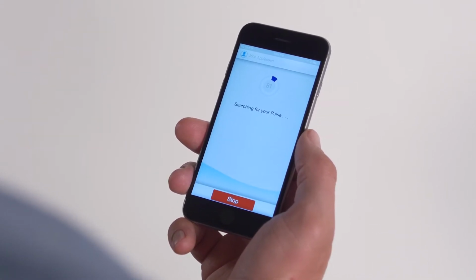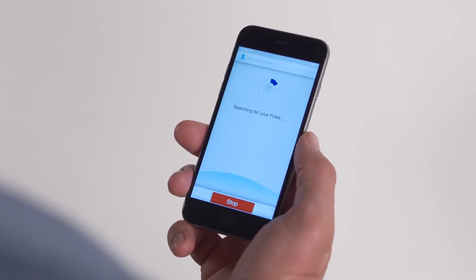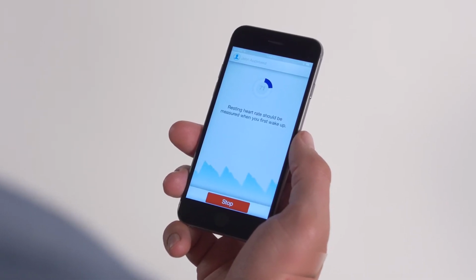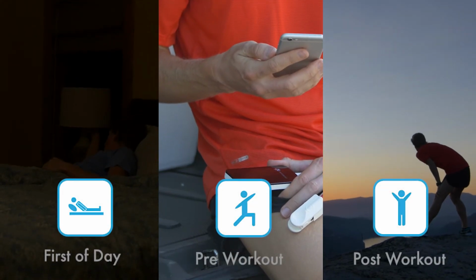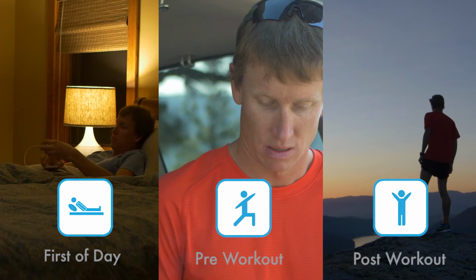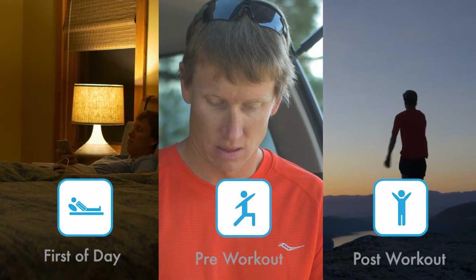Every time you test, the app will ask you to associate an activity with your measurement. By selecting activities with your consistent measuring technique and same finger, you're able to have a more powerful and precise historical review of your data. We recommend at least 3 measurements per day. First of day before you get out of bed and before your feet touch the floor, around 5 minutes pre-workout, and then 1 minute post-workout.